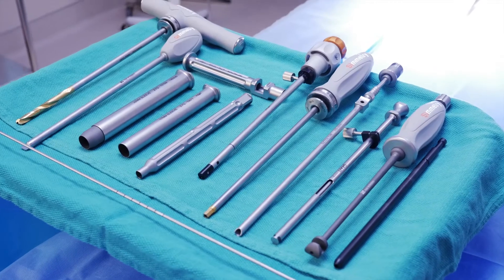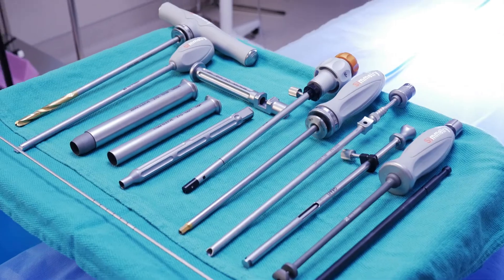An SI joint fusion procedure is a procedure that's done to immobilize the SI joint. Typically, an SI joint dysfunctions when either the ligament or the joint moves abnormally. There are several techniques that can be used to fuse the SI joint. This may involve using hardware or bone graft or both to fuse the SI joint.